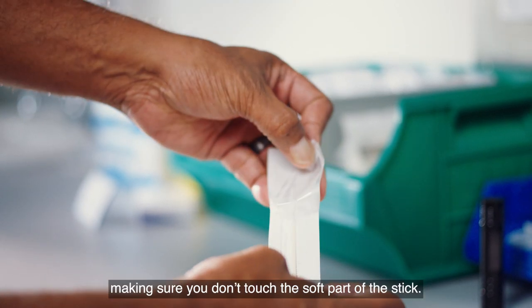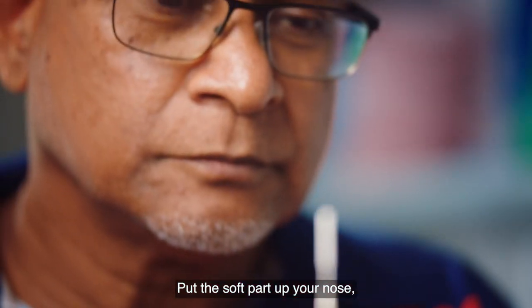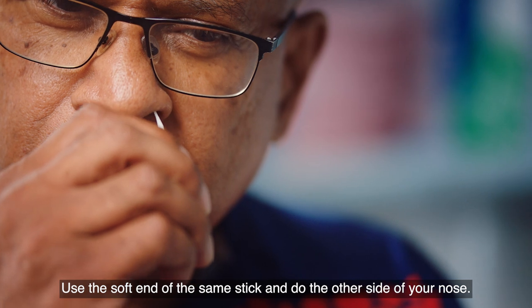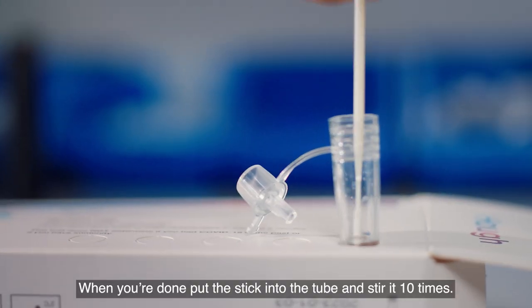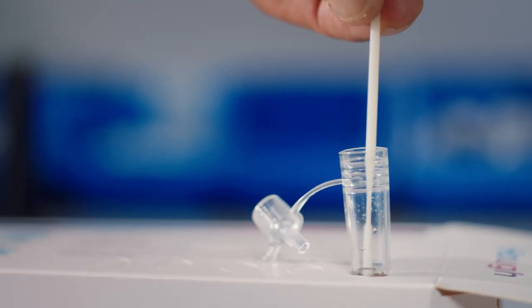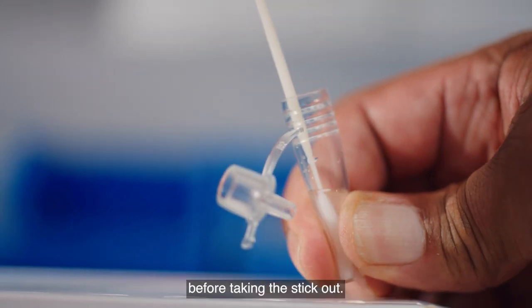Take the stick out of the packet, making sure you don't touch the soft part. Put the soft part up your nose all the way until you feel it touch the back of your nose. Keep moving the stick around. Use the soft end of the same stick and do the other side of your nose. When you're done, put the stick into the tube and stir it 10 times, then gently squeeze the sides of the tube together 10 times before taking the stick out.